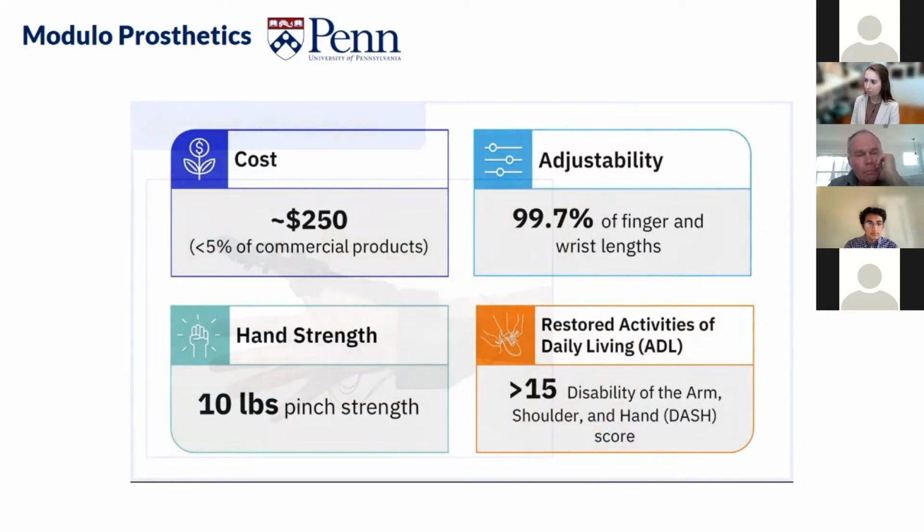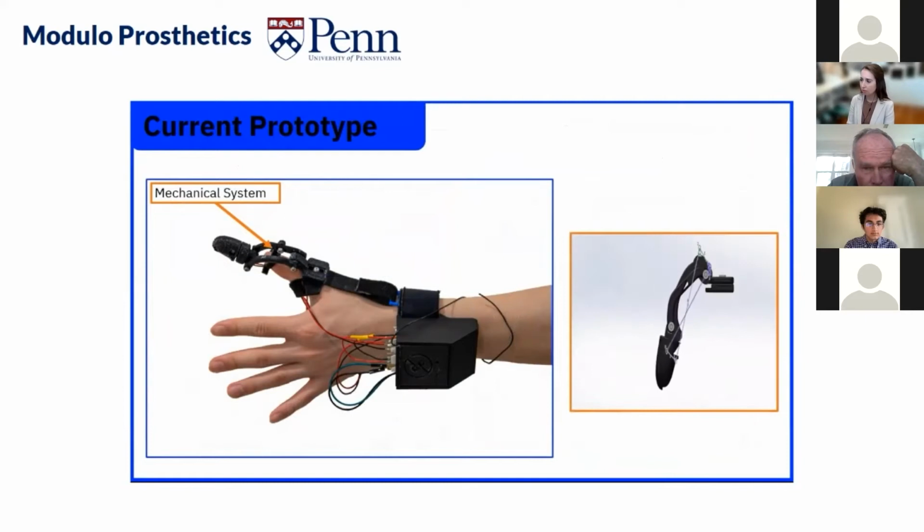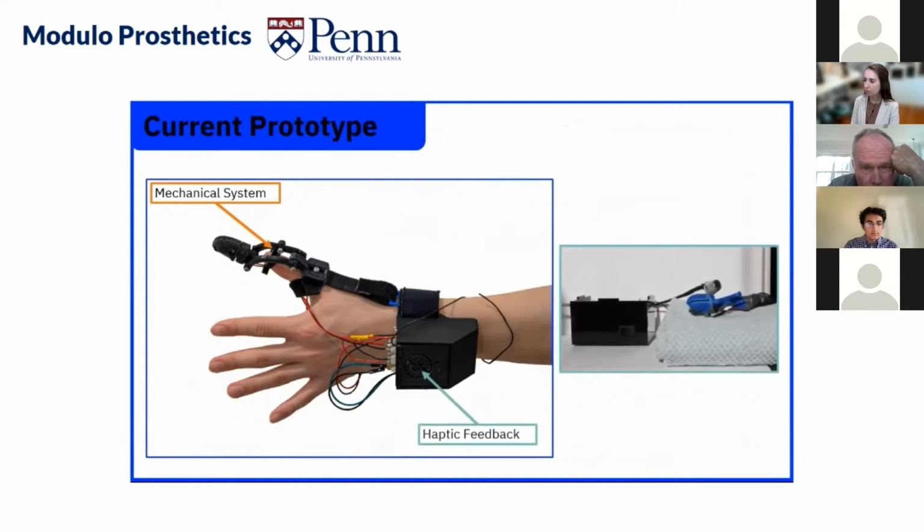Our functional prototype integrates the mechanical, electrical, and strap components into a sleek and intuitive design. Mechanically, our device is able to mimic thumb movement through a four-bar linkage mechanism. Bending of the remaining joint allows the user to actuate movement of the prosthetic tip as shown to the right. Electrically, we implemented a haptic feedback system that allows the user to assess the strength of the force applied on the tip through a vibration motor that varies in amplitude and frequency in relation to the applied force.